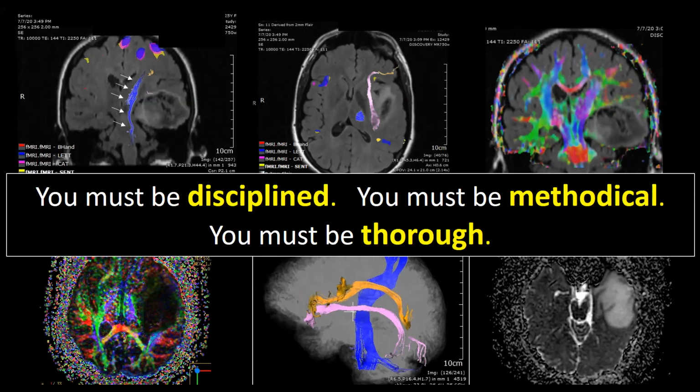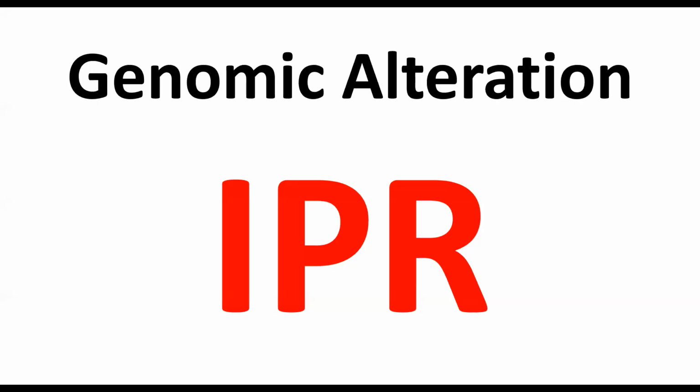In fact, it's the third time I've done it, because the initial thing I did is I think I showed a sagittal with the T2 FLAIR mismatch instead of a typical axial, where you're used to. So that's just a slight variation. But again, all of us need to get used to seeing the spectrum of morphology, and certainly in three planes. Got it?